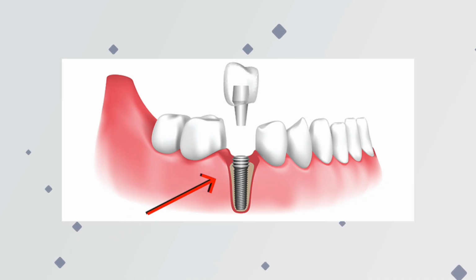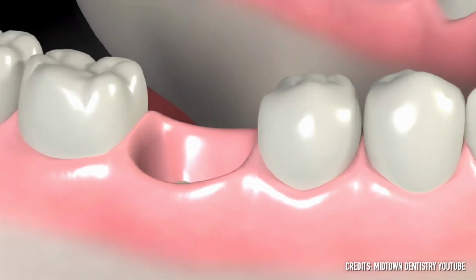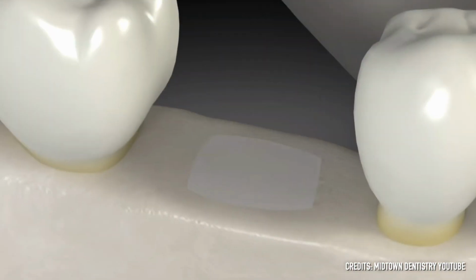When we extract the tooth, we have to find a solution to replace it. And in this case, we're fortunate enough to be able to place an implant as part of the treatment, which is the best option we have. But unfortunately, because of the active infection present, we can never place an implant the same day of an active infection, which makes the whole treatment a lot longer than normal. Instead of being able to take out the tooth and place an implant, we have to take out the tooth, place bone graft, and wait for it to heal.